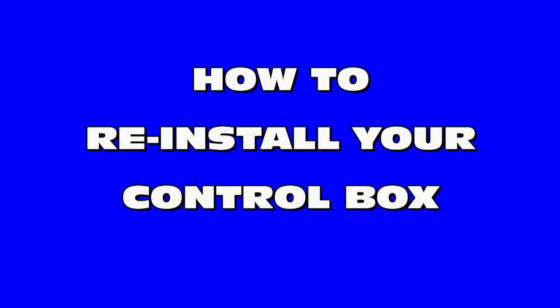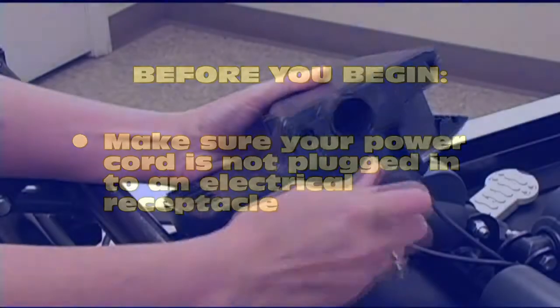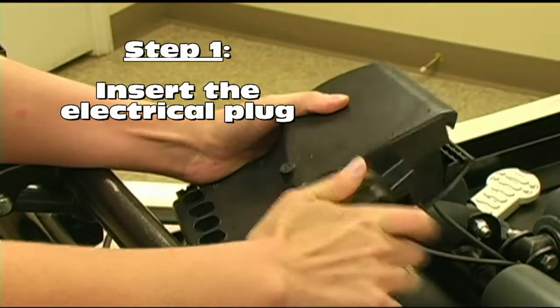Now that you have removed your old control box, you will need to install a new control box. Before you begin, please make sure that your power cord is not plugged into an electrical receptacle. The power cord should be plugged in after you have completely finished installing the control box. The first step in installing your new control box is to insert the electrical plug into the control box as seen here.